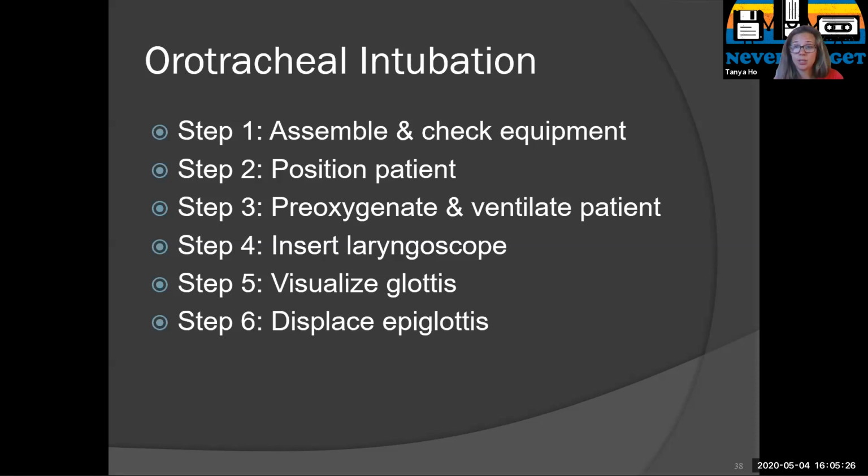Okay, we're going to pre-oxygenate the patient. So during this time, if they're still spontaneously breathing, they'll be on a non-rebreather mask or something like that. If they're not, you will be manually ventilating them with a high FiO2 in your manual resuscitation bag. You can have a PEEP valve, which we will talk about later, but this will be another thing you might want for your ambu bag. So we're going to pre-oxygenate, and make sure the saturations are as high as possible prior to the procedure, and then they'll go ahead and give the drugs, if necessary.